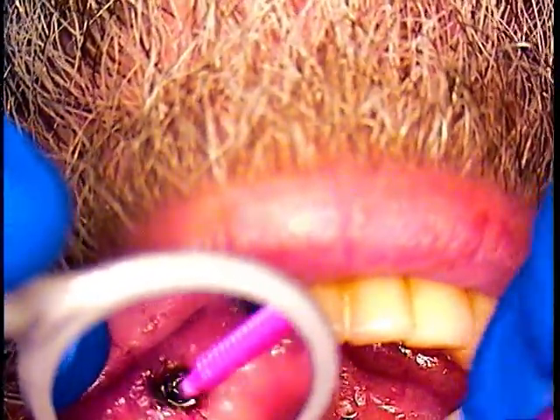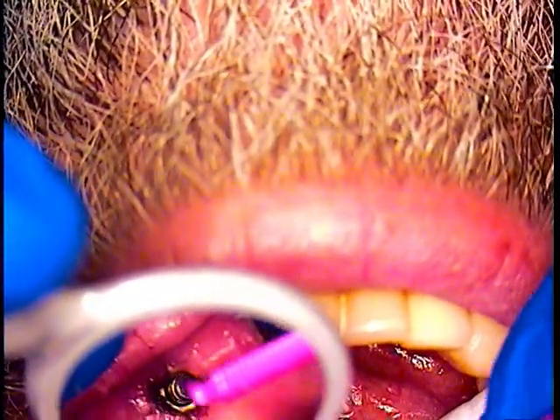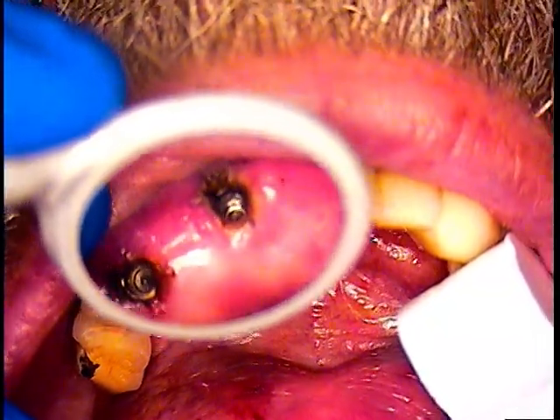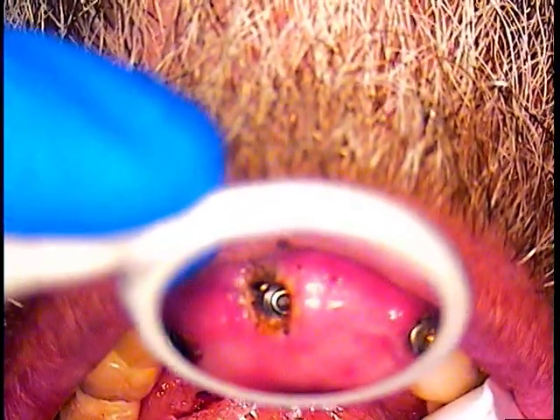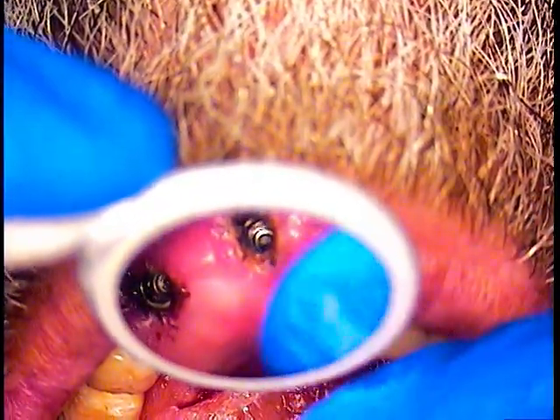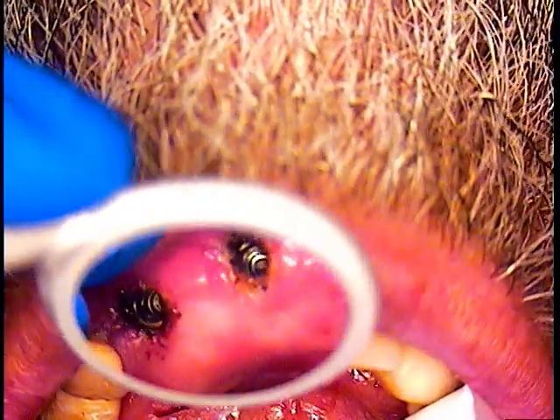All right, so we've been pre-soaking the other side. Now that other fragment is ready to come out. We're going to let this soak in there and clean the internal threads now. Look how black that is. When that becomes clear, when there's no longer any color, then we know we've done our job. Then we're going to follow this up with implant healing abutments. That would be the third segment of today. We're going to put the healing abutment so the patient can go home and let that heal up in a couple of days, and the doc can now go back in and maybe take a new impression or add an implant, whatever she wants to do on this case to put it all back together again, make it right.